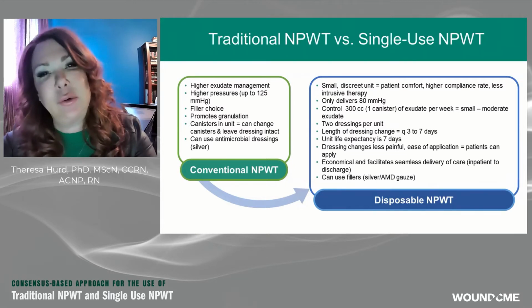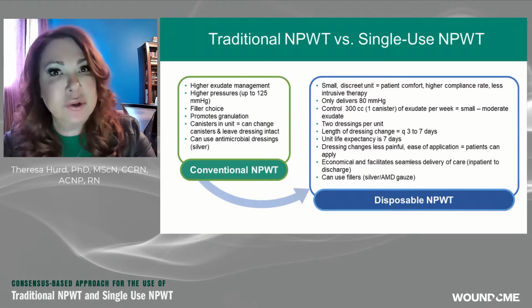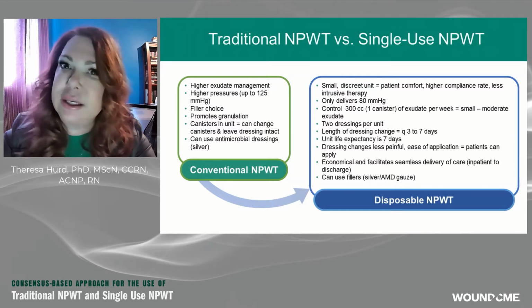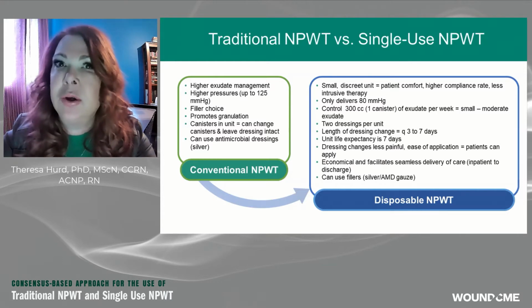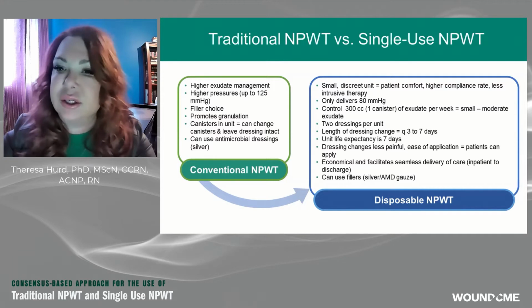So this is another thing. When you choose a drug, you may have two drugs that do the same thing, but one drug might cause side effects that will cause the patient to not adhere to the treatment. And this is what we found with negative pressure. In other words, if I could use single disposable negative pressure, I had a higher compliance with this kind of patient. And that's just an example.